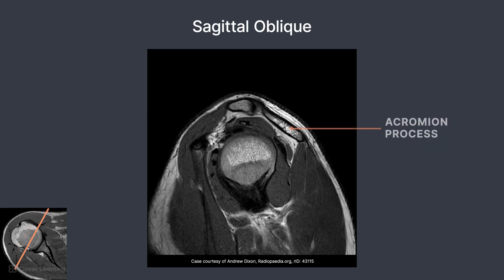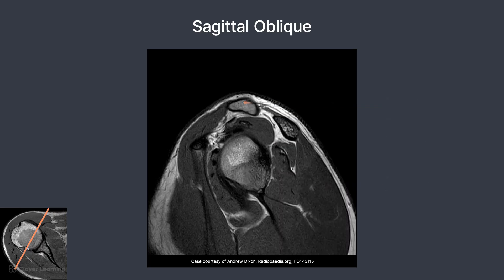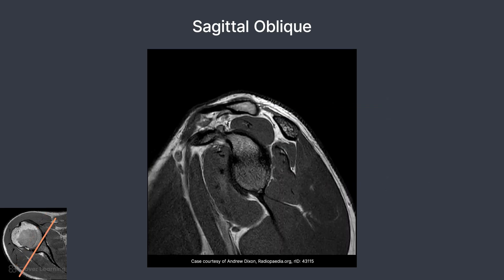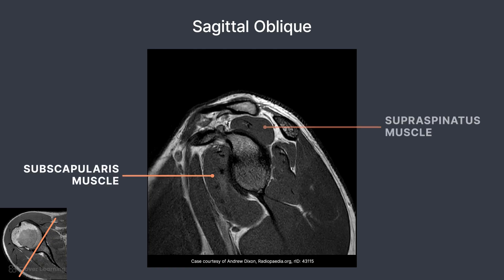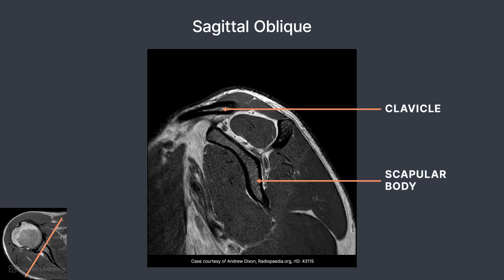Here, you can see where the acromion and clavicle meet — the acromioclavicular joint. We can begin to see a portion of all the muscles of the rotator cuff here. This includes the subscapularis, supraspinatus, infraspinatus, and teres minor. The coracoid process is also demonstrated. The clavicle, scapular body, and scapular spine are better demonstrated on this slice.